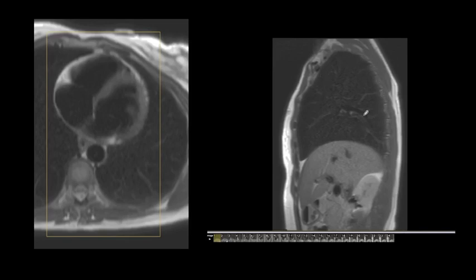If we are to acquire in the sagittal, as you can see here, again a number of slices. And we choose the one slice from the transaxial where you have the biggest transverse diameter of the heart, and you go just outside the heart, covering anterior and posterior chest wall. You are not interested in the lung here or here. So our region of interest is the heart.